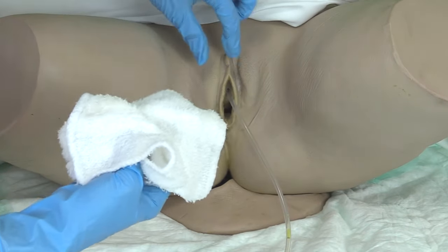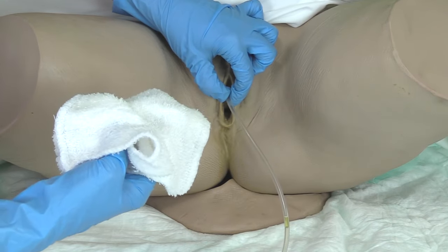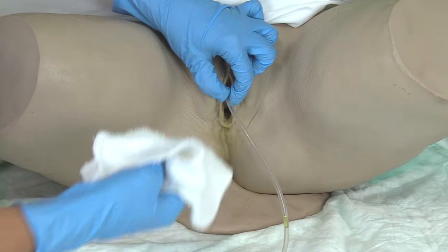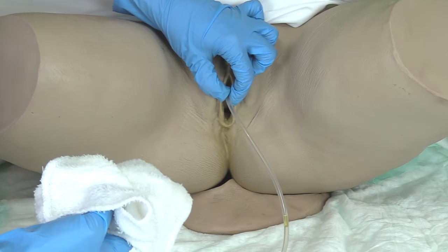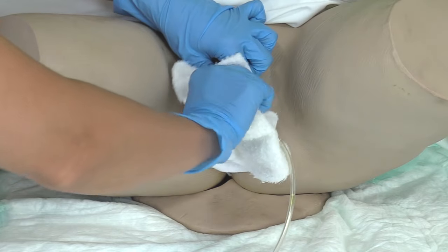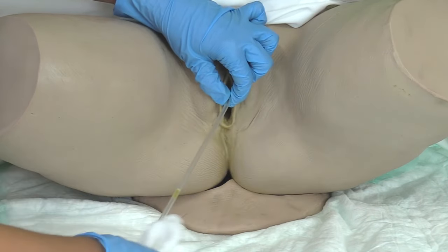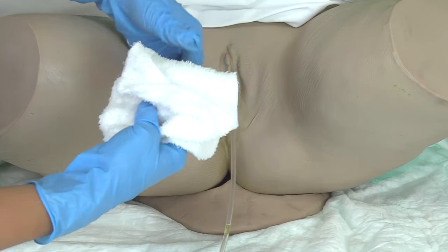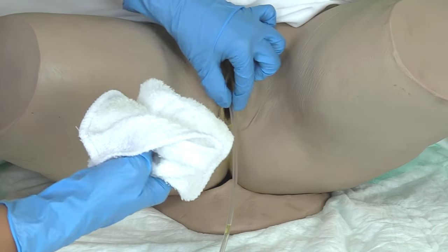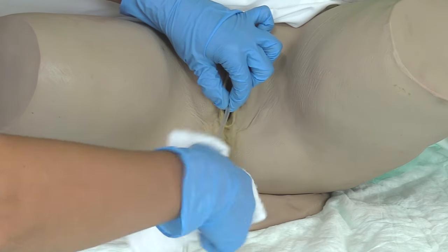But this time what we're going to do is hold this catheter line about right here. And we're gonna go down in a circular motion and clean the rest of this tubing all the way to the bifurcation. So we're holding it steady so we're not putting tension on it, and we're just going down that line all the way to the bifurcation. Then we're going to pull back that leaf. We're on our fourth leaf, and we're going to repeat this again. We're applying soap and water to all of this.